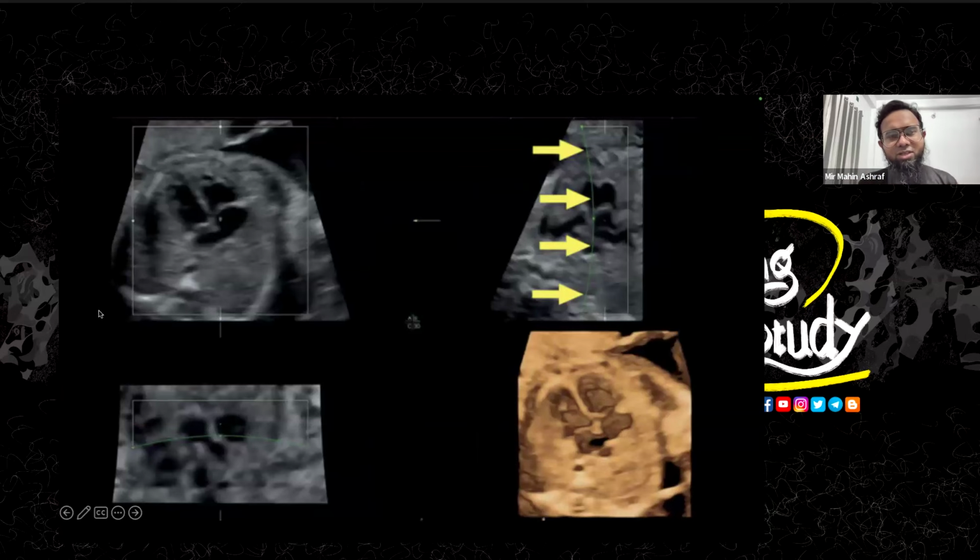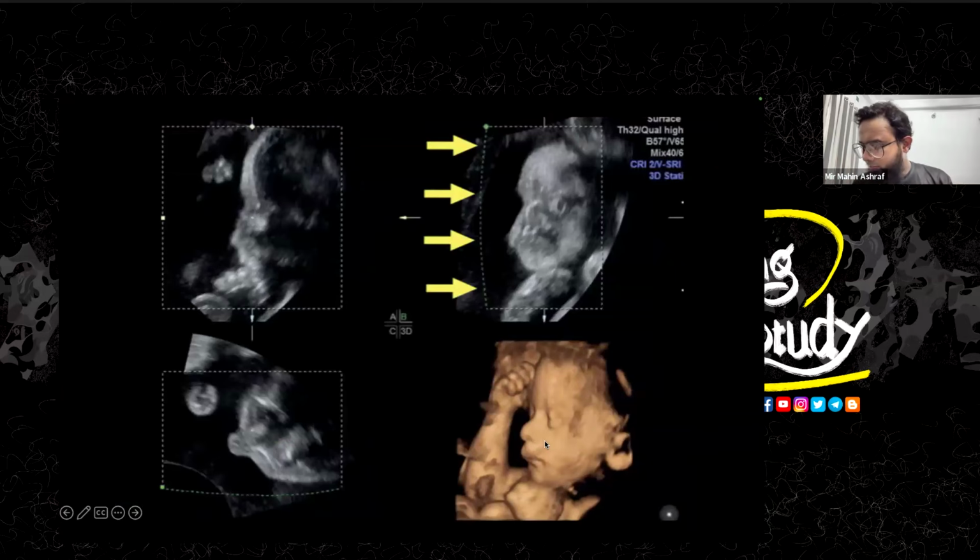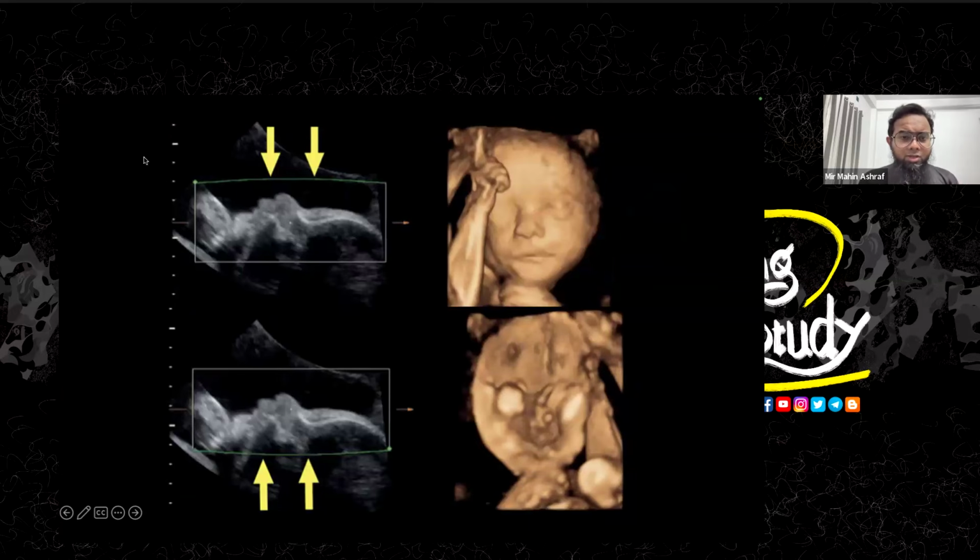Here we have put the section of the fetal cardiac four-chamber view. There is a pointer which we have put at the central part through the cursor. Then we adjusted this line because we want to see the center of the heart. After this adjustment, now you can see this four-chamber view over here. Just let me check a little. Okay. Here we couldn't make a good picture on the grayscale. So we took the raw data, then we adjusted these lines, and now we can get a good picture. All this is happening because of these adjustments.